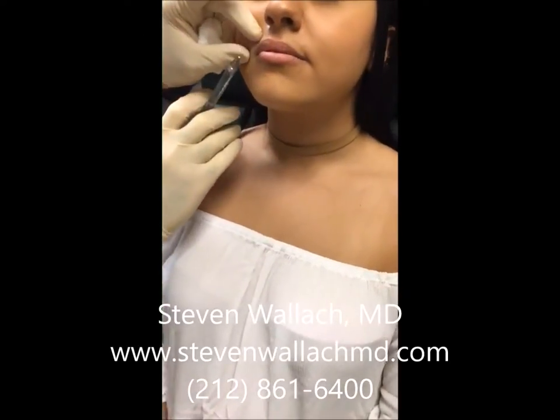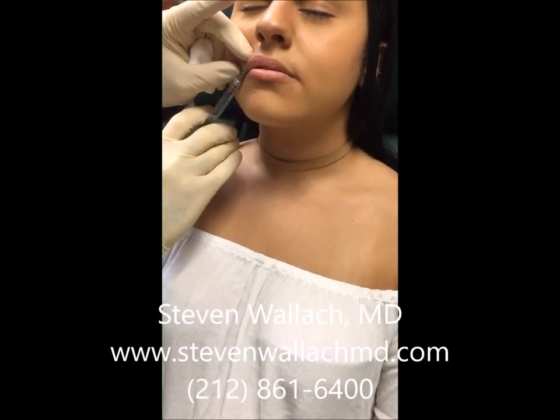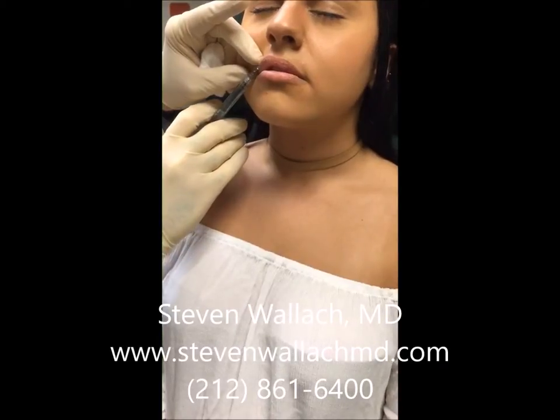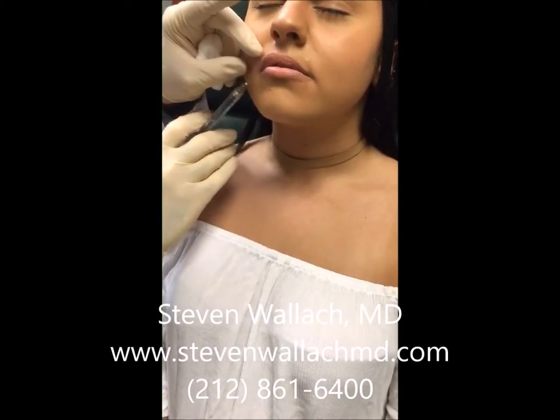This is a video of lip augmentation using Juvederm Ultra Plus. Before inserting the injection, I always put topical anesthetic on. As you can see, the patient is very comfortable during the procedure.